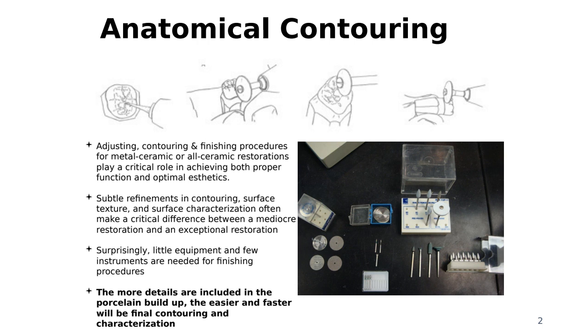Instead of just taking a big block of porcelain and applying it on the coping and making it like a square, right? And then you grind it. You actually work like the wax-up. Take a little bit of the porcelain and just add it where needed to make the shape, right? And also anatomical contouring means the porcelain shrinks a little bit. So sometimes we add a little more porcelain because it shrinks. So sometimes we need to adjust the porcelain at the end, after we finish the second bake, when we have the majority of the shape done.